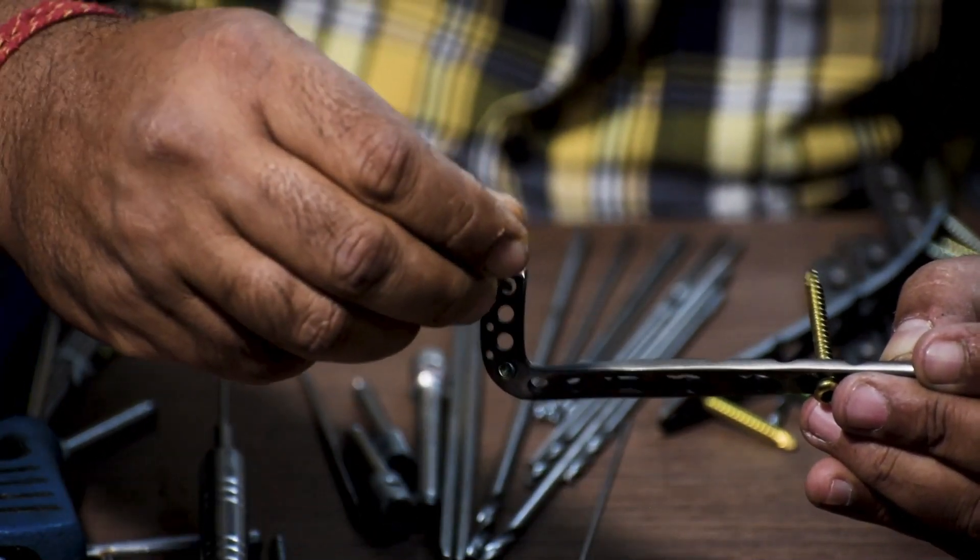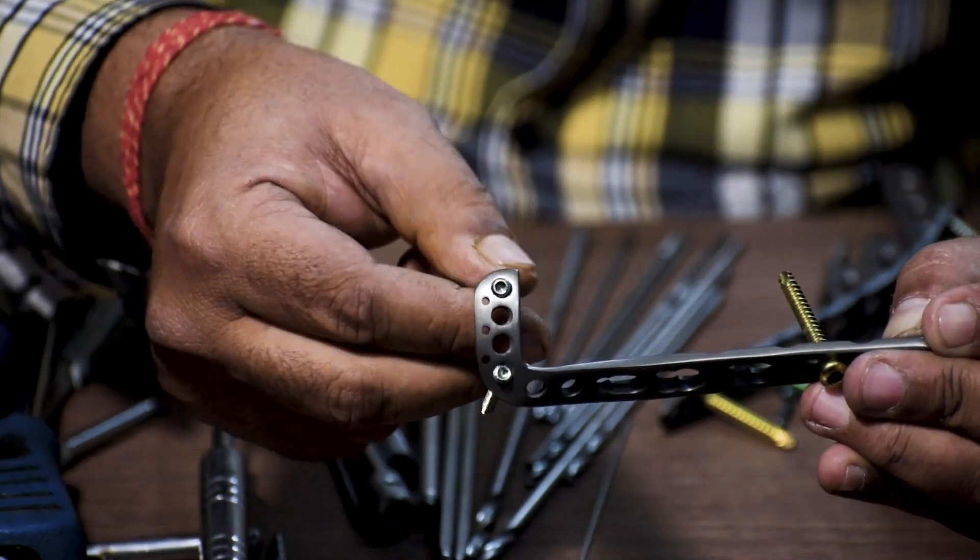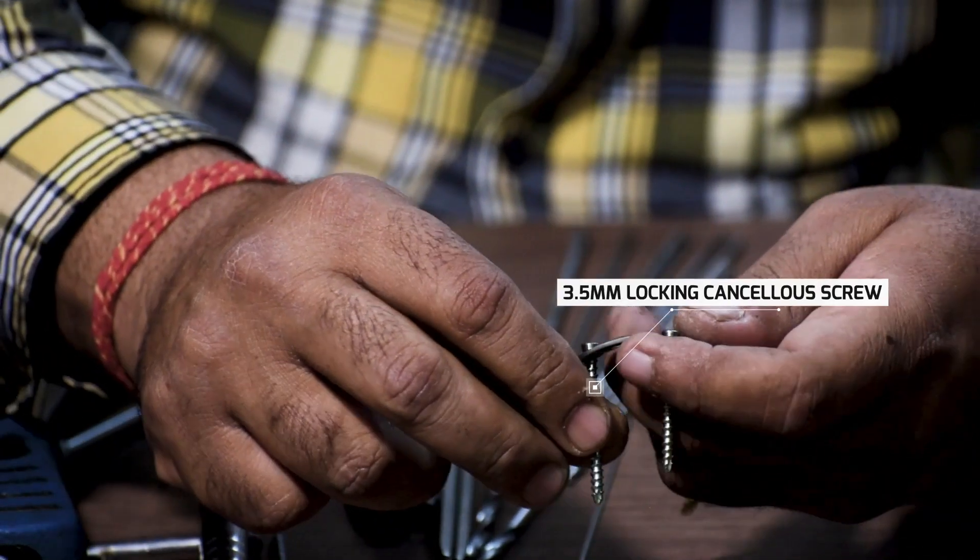As discussed earlier, the distal part is basically cancellous, so we fix this with a locking cancellous screw.